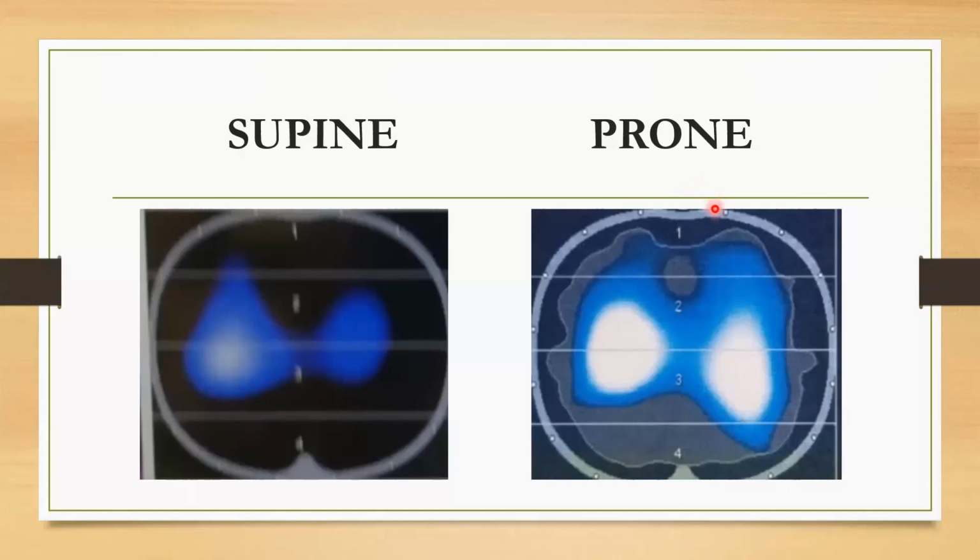Again, don't look at the template. I put the belt on backwards. So this is actually what the lung looks like. The chest would be here, the spine would be here. This would be the right side and the left side. There's a little bit here of lack of ventilation, perhaps because of the pressure of the patient lying on their chest. This was an opening.